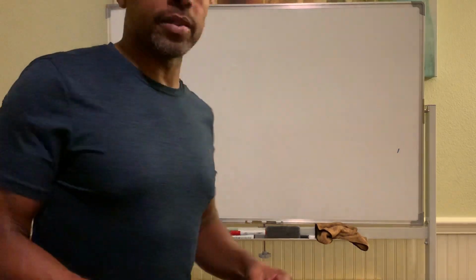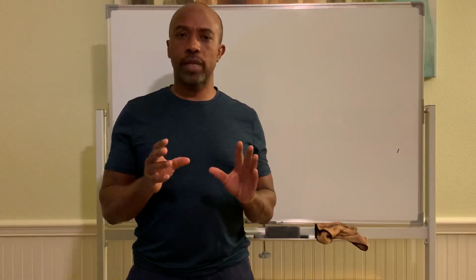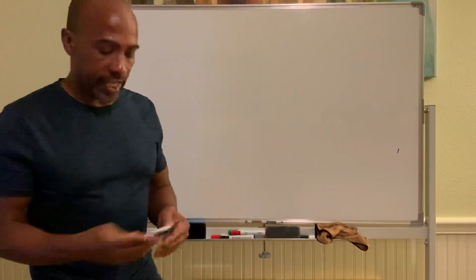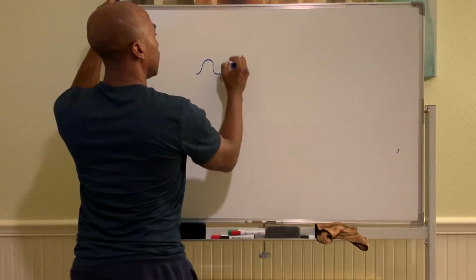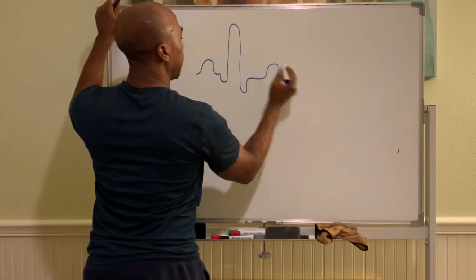Okay, let's talk about the labs that are due tomorrow. So you are to do two labs. One is on EKG, where you will analyze an EKG. Remember, an EKG gives you your P, Q, R, S, and T wave.